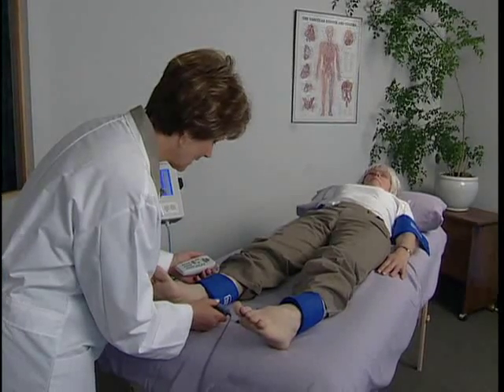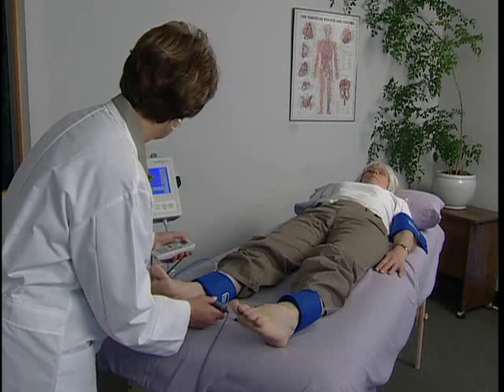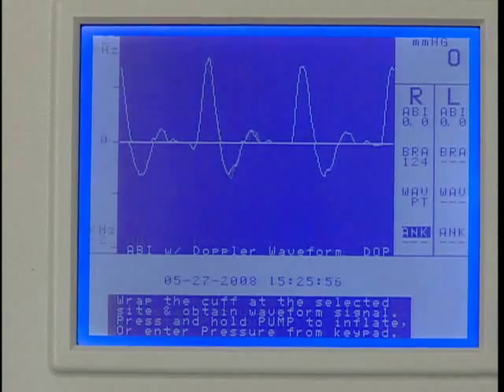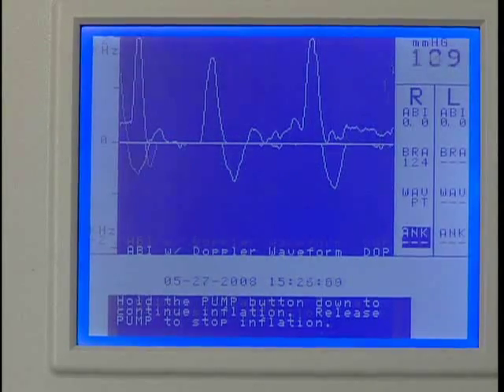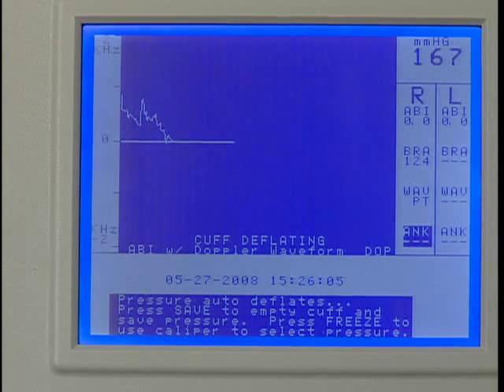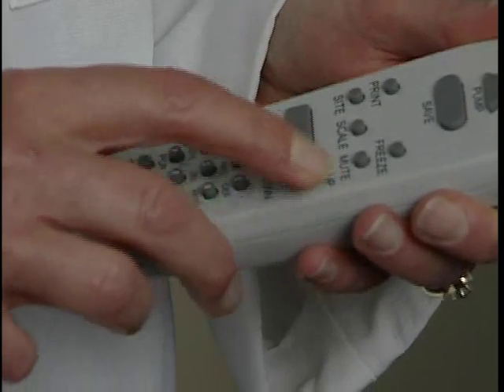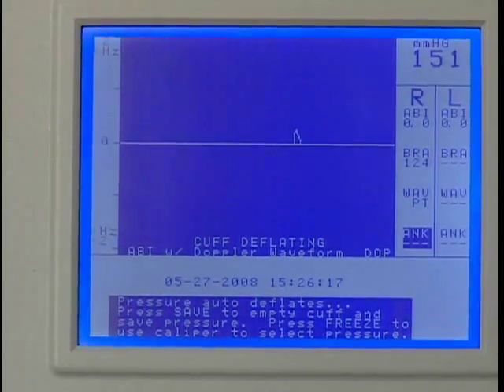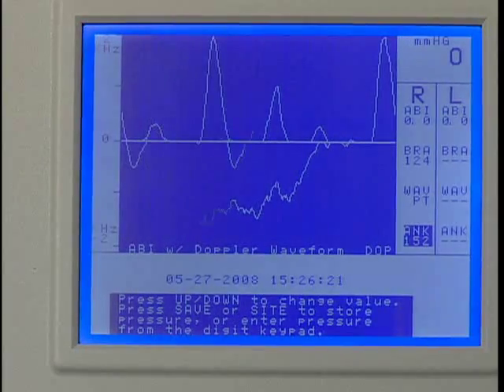Next, obtain the ankle pressure using the Doppler probe. While holding the probe steady on the artery, press and hold pump to about 20 millimeters of mercury above the occlusion pressure. Release pump and the cuff will automatically start to deflate. When you hear the first pulsation return, press Save and use the up or down key to adjust the pressure reading if needed. Press Save to record the systolic pressure and the marker will move to the next protocol location.